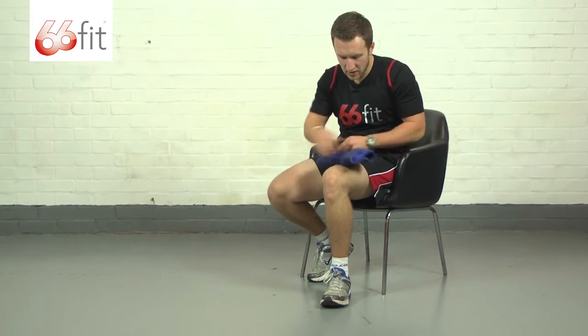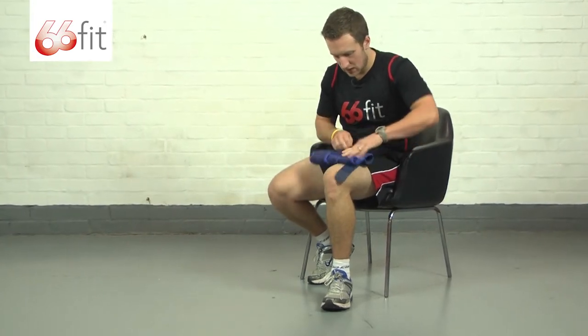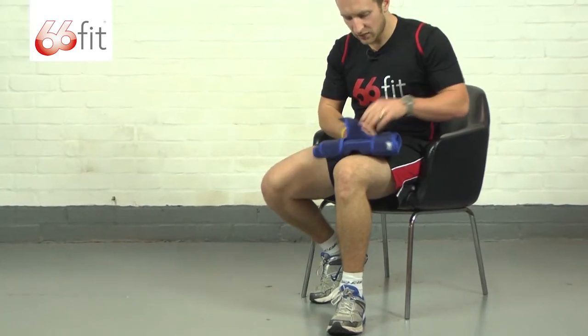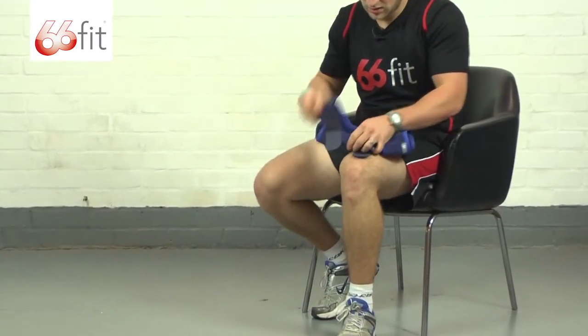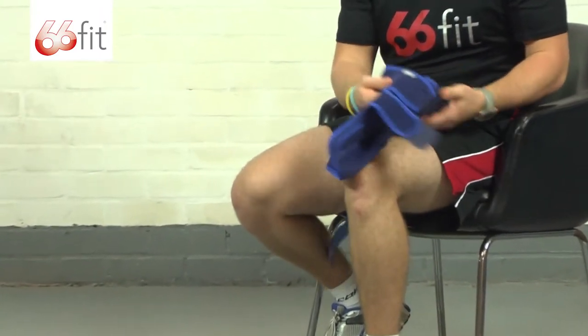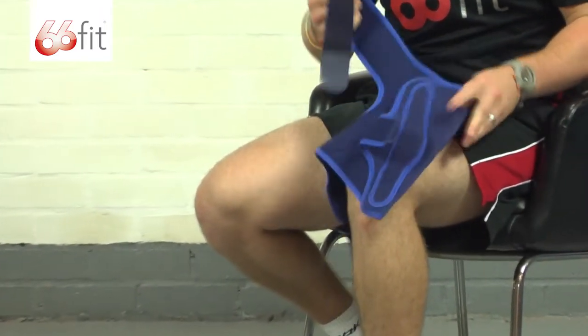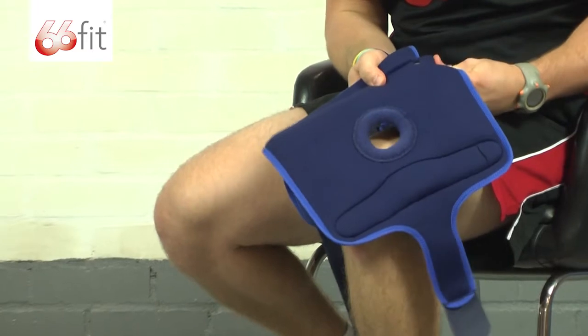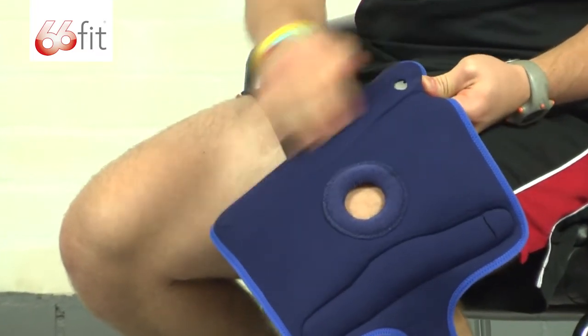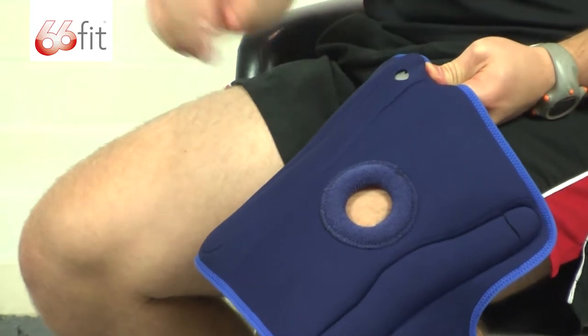The support itself is completely washable, and for ease of use and for washing it, the actual hinges that run the length of the support can be taken out through this little opening here. So you can just slide those out and then easily put them back in.